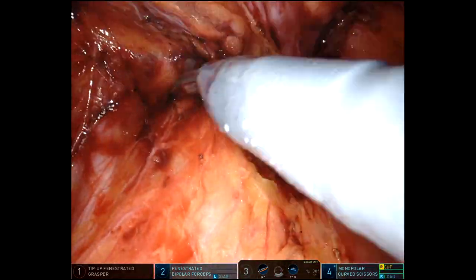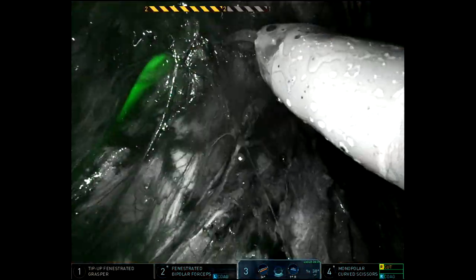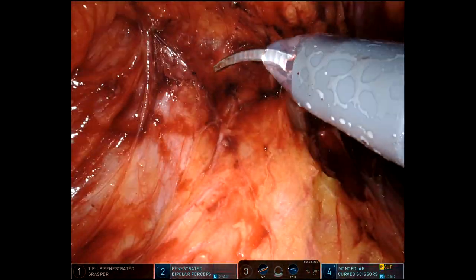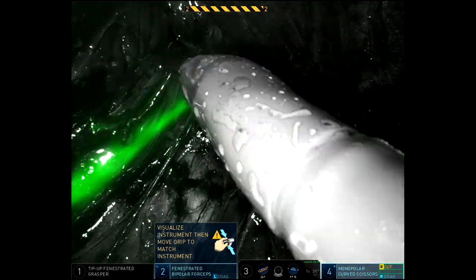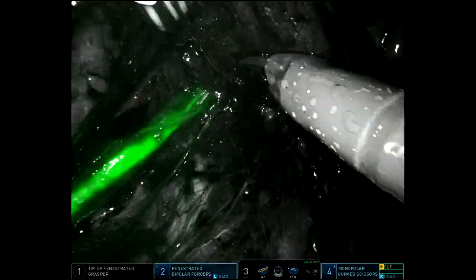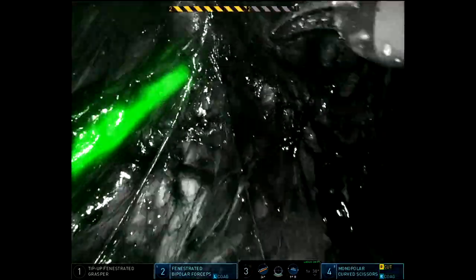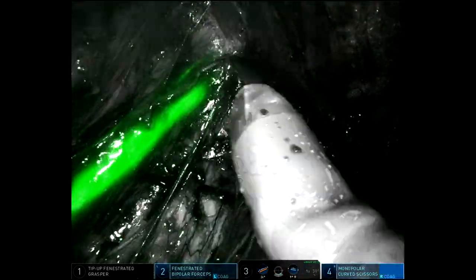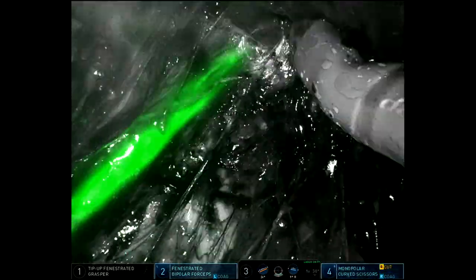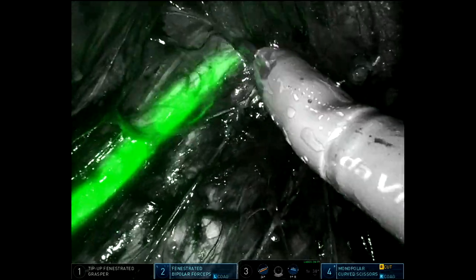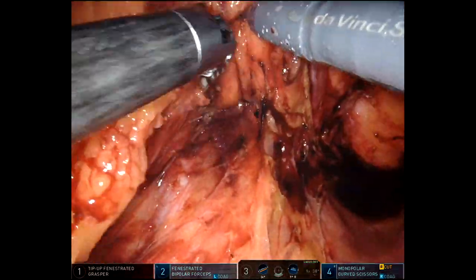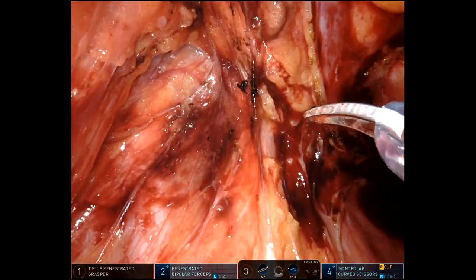Here I'm trying to dissect down into the pelvis, and the ureter is really intimately involved in this inflammatory reaction. Being able to keep ICG mode on, you can really do a meticulous dissection without concern for injury.